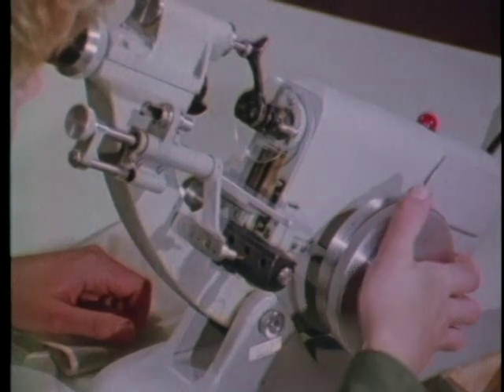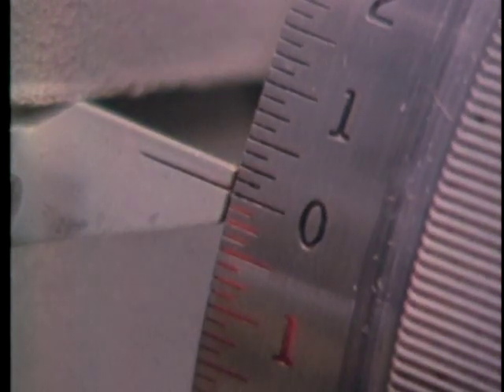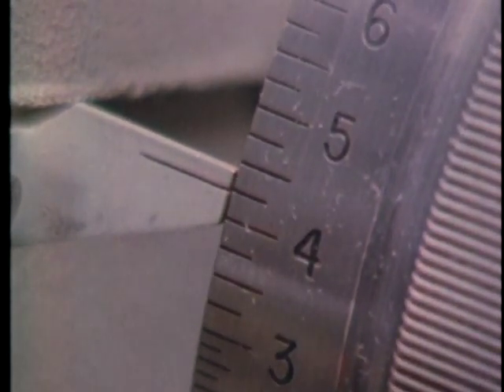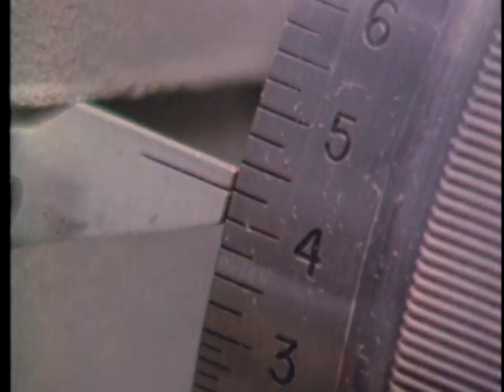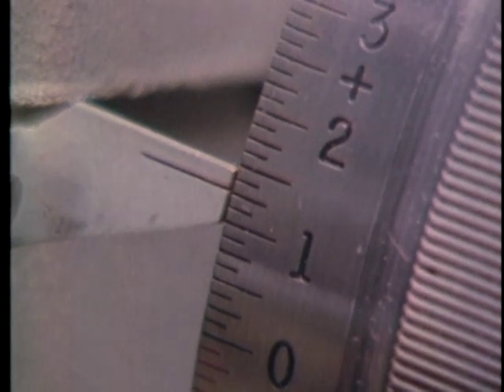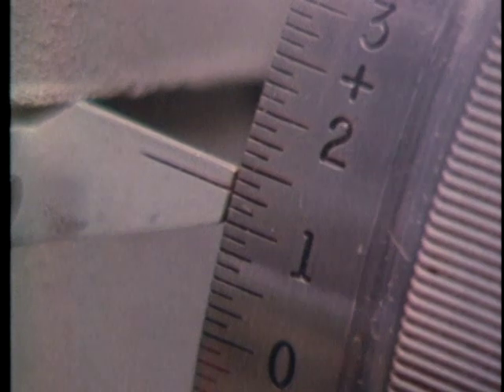Note that the power wheel is marked in one-eighths of a diopter in the lower range for plus and minus. Above three diopters, it's marked in one-fourths for plus and minus. What's this reading? If you said plus one and a quarter diopters, you're right.